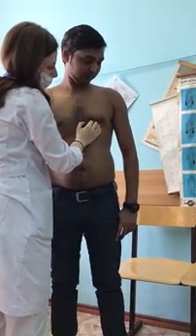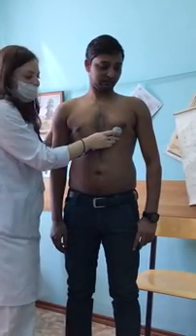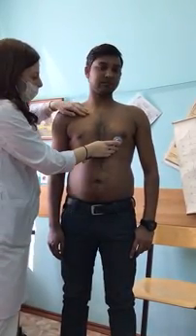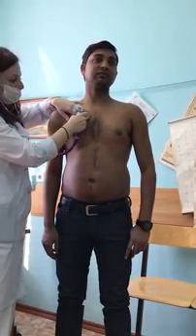This patient has no apex beat, so here we will put the stethoscope and listen to the mitral valve. Then we find the second intercostal space at the right edge of the sternum.